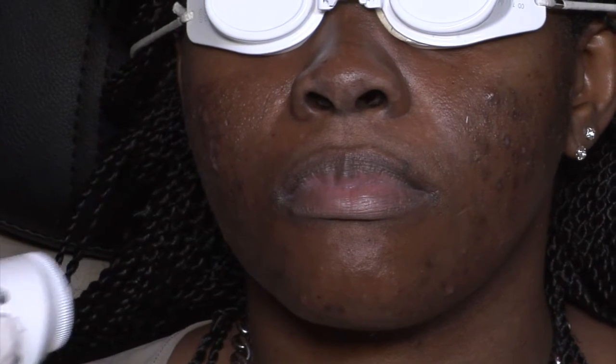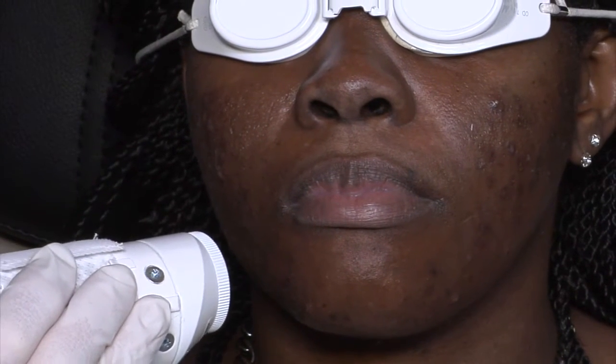The funny part is, I don't know if you can see it, but there's almost a perception of a little bit of smoke. Those are actually little hairs that are getting singed.